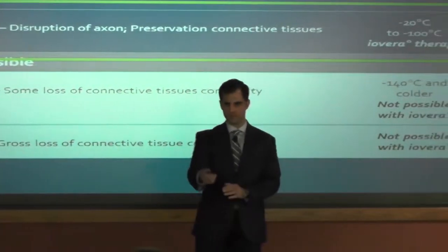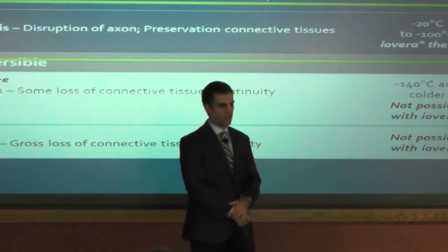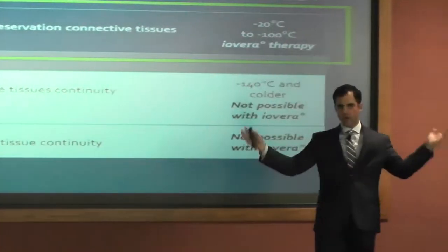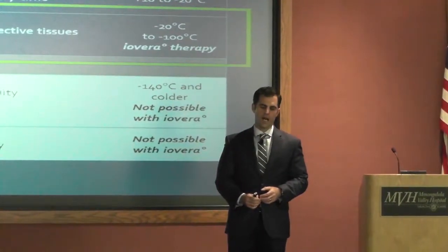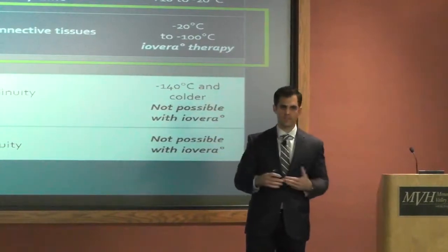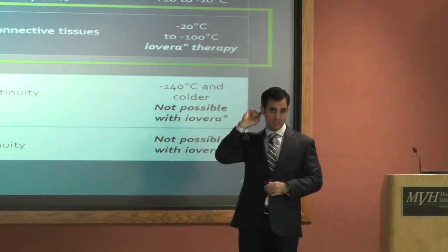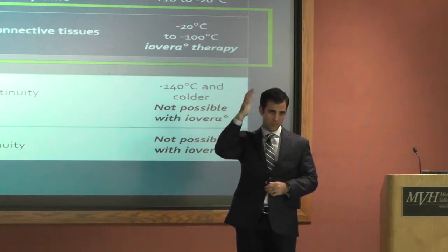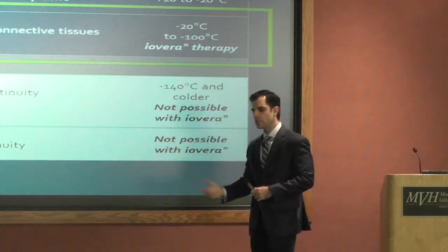Can you use it on different parts of the body? Yes. The device company likes to say there's a variety of other conditions that this can be used for. Knee arthritis is the most well-studied one. There's also a nerve in the back of the neck that can be treated with this. That can cause pain in the neck that goes to the head, like a headache type sensation. That's the next best studied area.